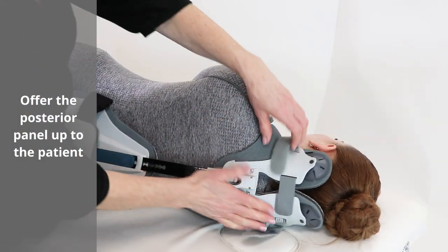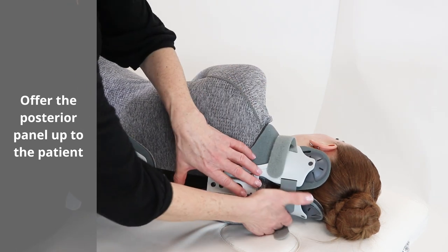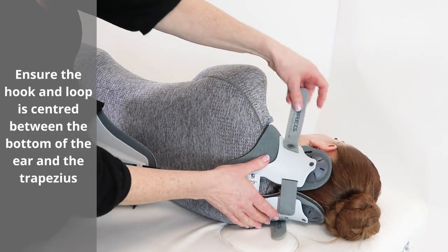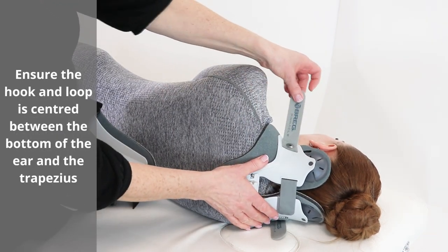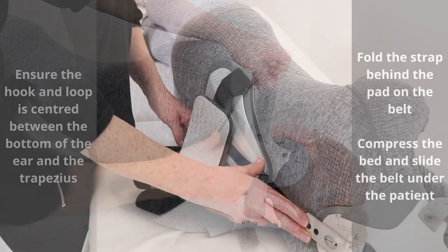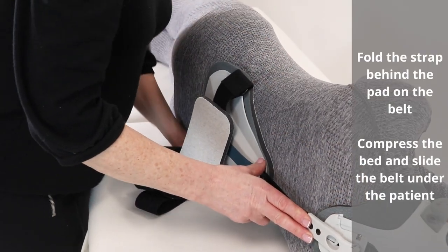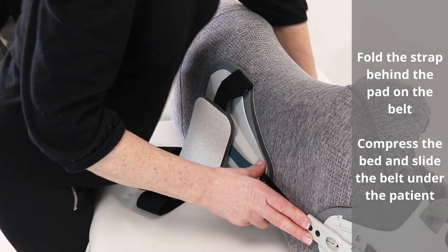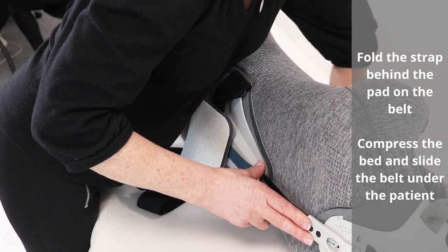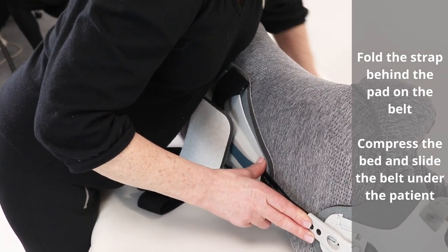Offer the posterior panel up to the patient. Ensure the hook and loop is centred between the bottom of the ear and the trapezius. Fold the strap behind the pad on the belt, then compress the bed and slide the belt under the patient.